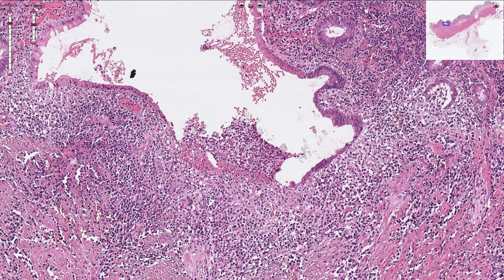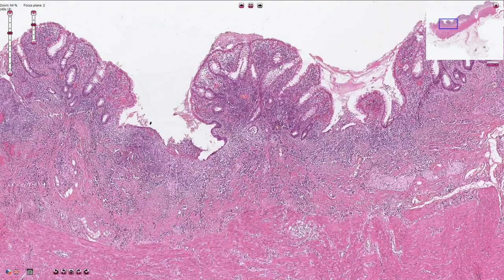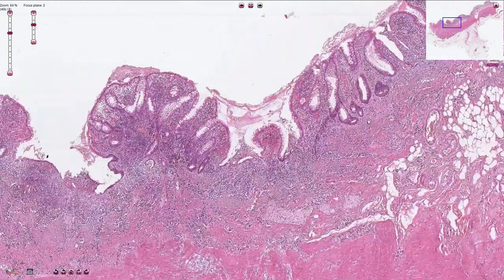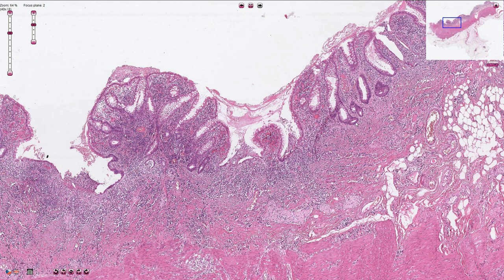We can see ulceration with superficial fibrinous exudate containing fibrin and neutrophils. The inflammation is limited to the superficial portion of the colon; deeper parts such as the submucosa and muscularis propria should be without inflammation.